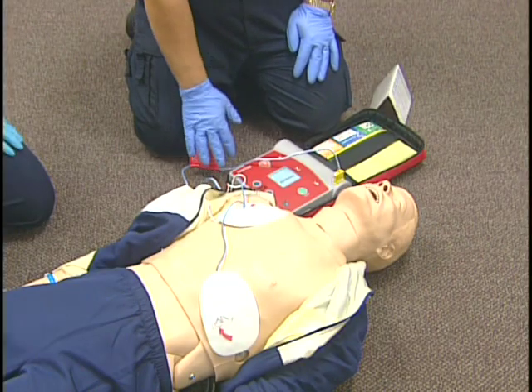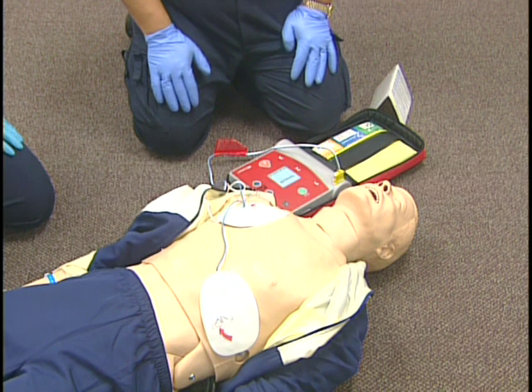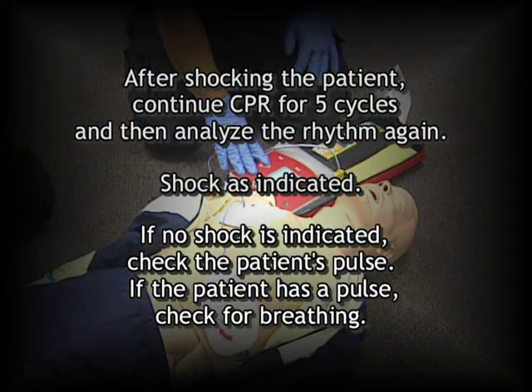Shock advised. Charging. Stay clear of patient. Deliver shock now. Press. Okay, everybody clear? After shocking the patient, continue CPR for 5 cycles and then analyze the rhythm again.